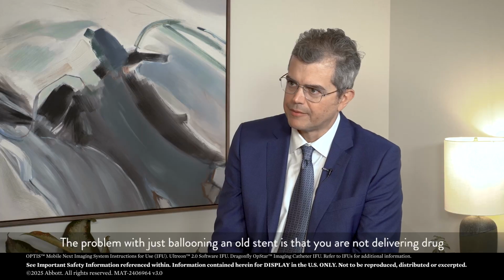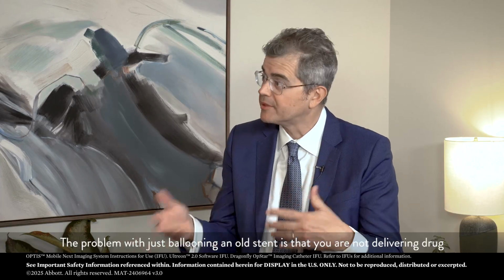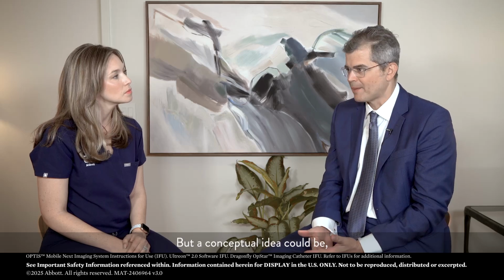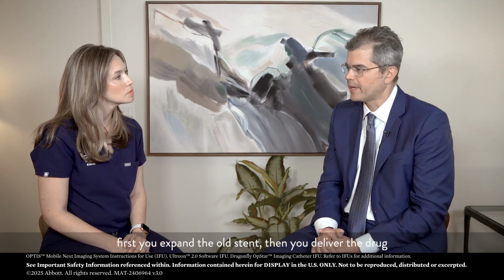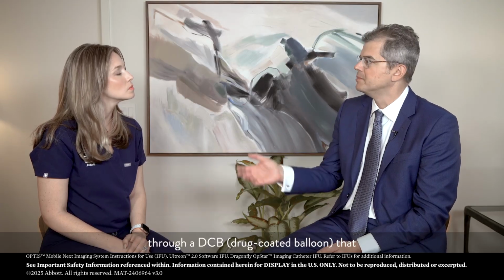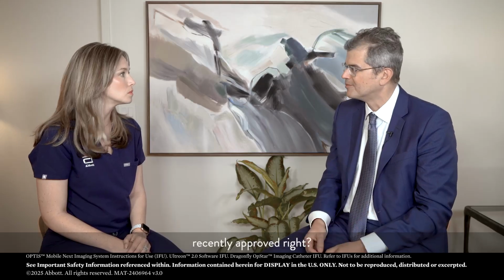The problem with just ballooning an old stent is that you are not delivering drug in that environment. But a conceptual idea could be you expand the old stent and you deliver the drug through a DCB that was recently approved, right?